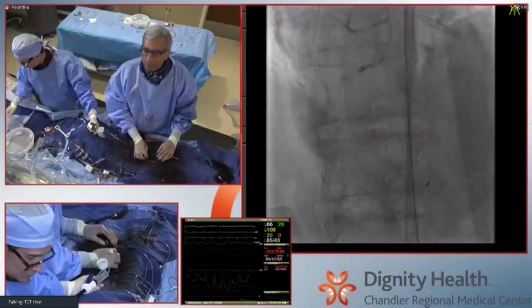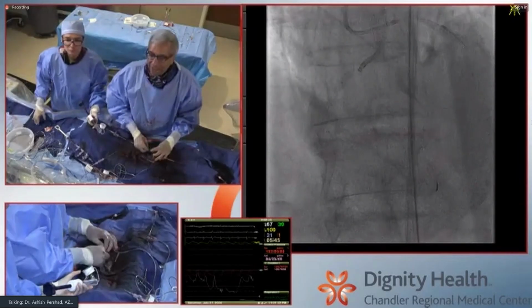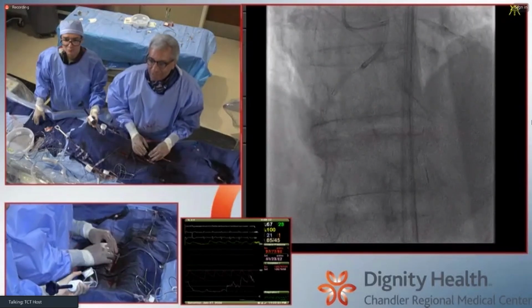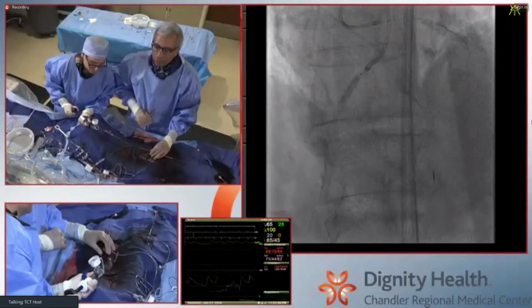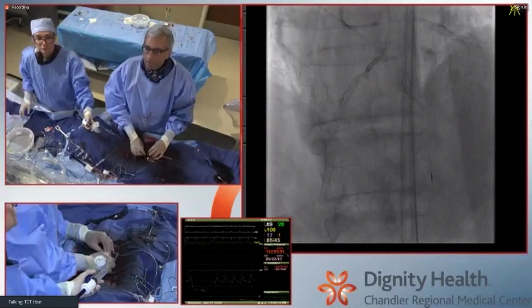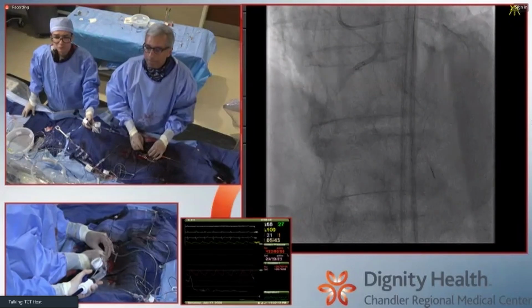The other thing I noticed, Ashish, is that you've taken very few pictures, which I know I had to do that, is commendable, right? That's the point, you're not ruining the vessel in front of you by antegrade contrast over and over. And from a retrograde perspective, you really don't need it. What purpose does it serve? The only thing, arguably, you might make the argument for is a picture when the pressure starts to get low retrograde, to make sure you don't actually have an injury.